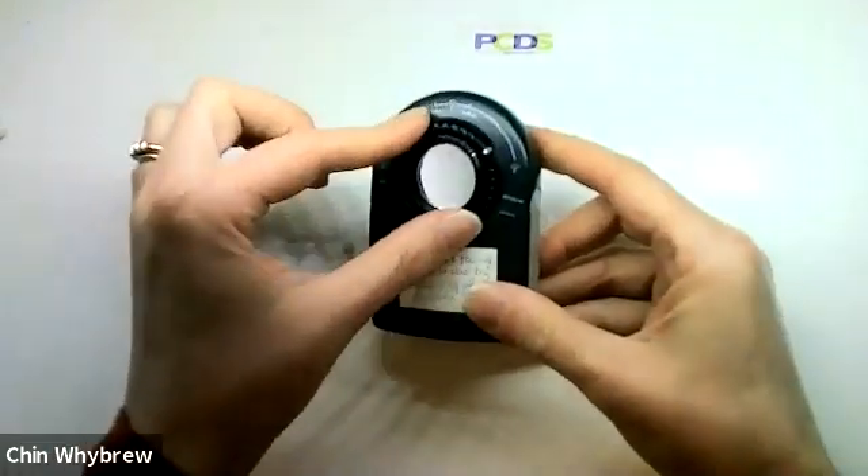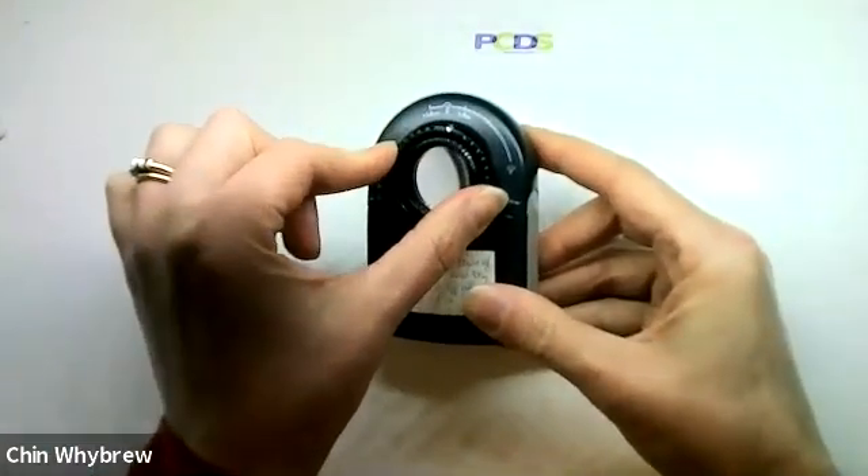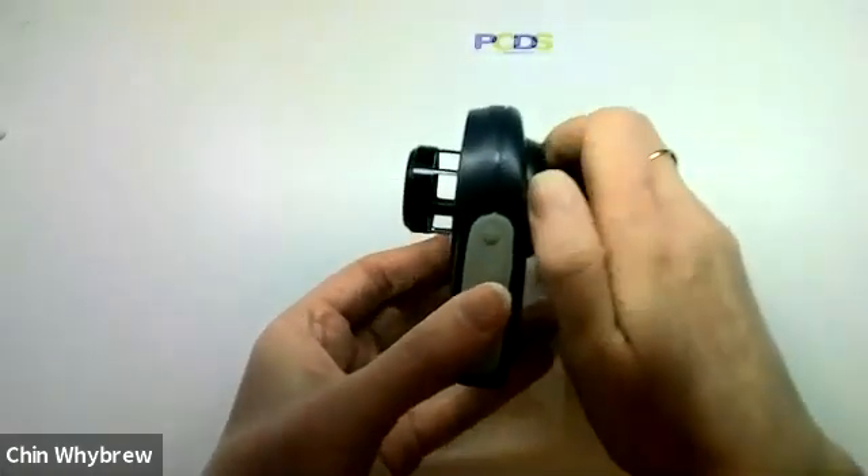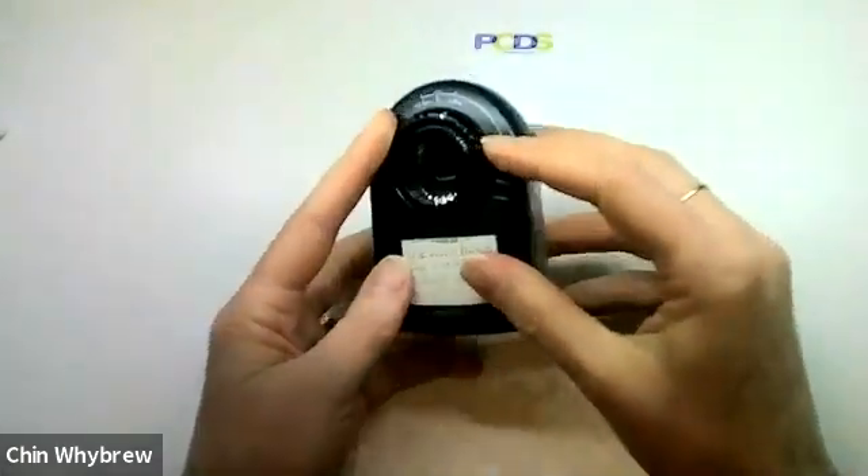To focus it, you twist this part here, and as you twist it, the end plate extends and retracts. And this is rather neat.